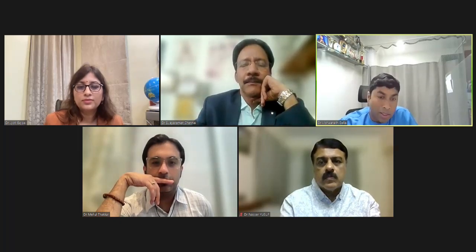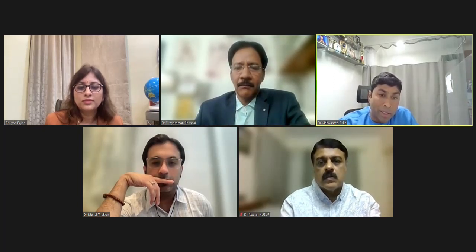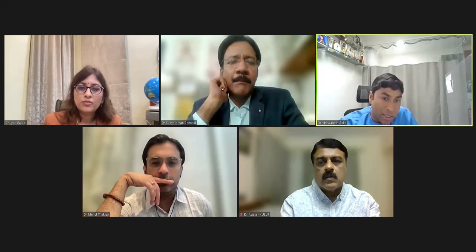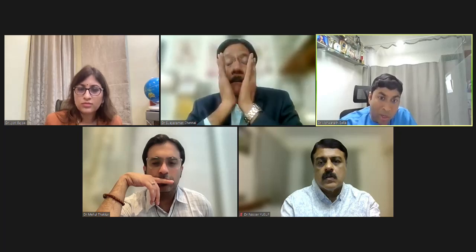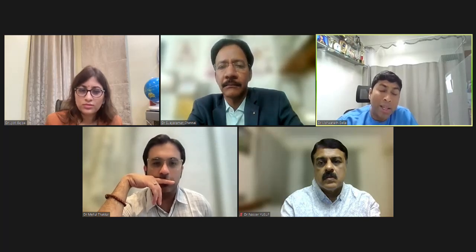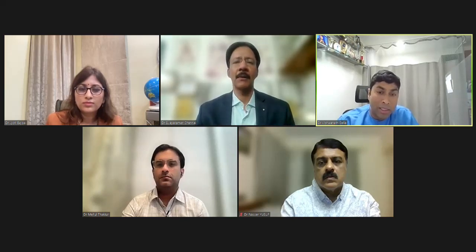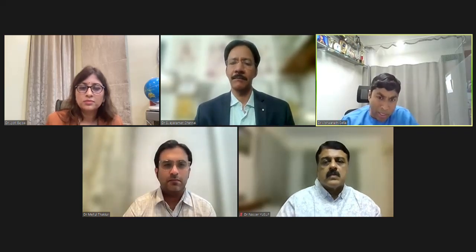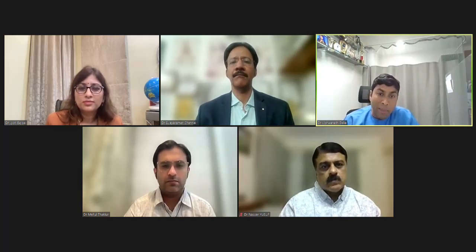We are going to have these kinds of patients in our ICU when managing ARDS patients. Coming to regular pulmonary practice, the indications are expanding. Earlier it started with cryo lung biopsy. Now we have started doing lung nodule biopsy with a 1.1 mm cryo probe. And now we are doing cryo EBUS TBNA with the same 1.1 mm probe to get larger tissue. We need more evidence for that, obviously, but it is coming into many fields. Cryospray therapy is going to come, but that is still investigational. At least I can say with confidence that cryo lung biopsies, lung nodule biopsies, and cryo EBUS have a role.